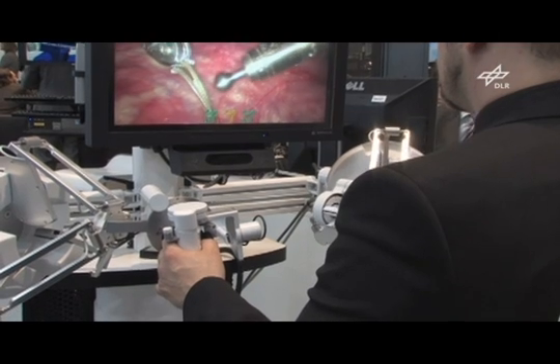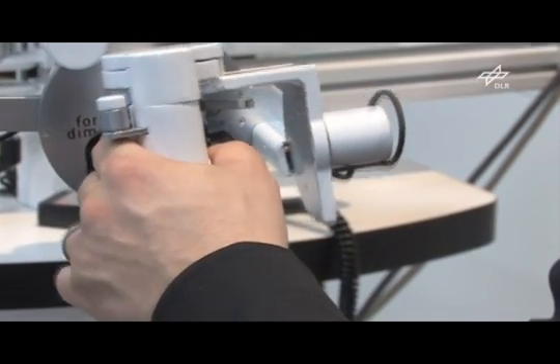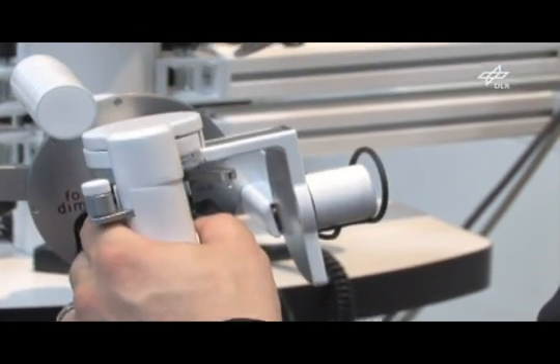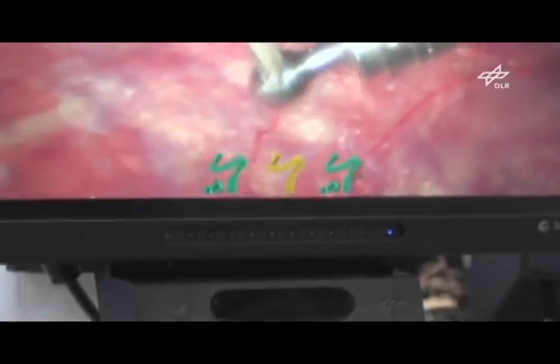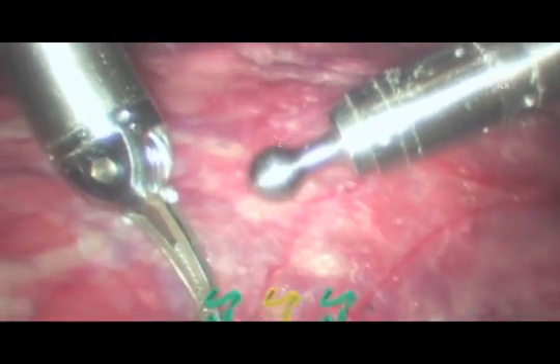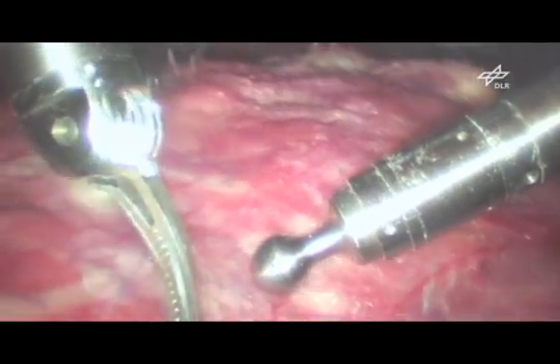The surgeon moves two input devices, which control the position and orientation of the two instruments inside the patient's body. In addition, the instruments measure the forces that appear during contact with the organs and return this information to the surgeon. Thus, the surgeon feels exactly what the instruments feel as they push the organs.